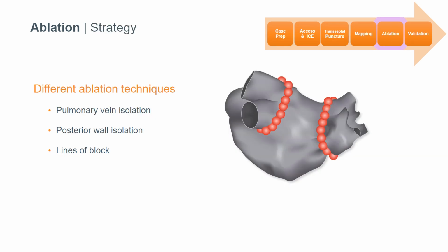The EP physician may use several different ablation strategies during an atrial fibrillation procedure. The most common, pulmonary vein isolation, involves ablation to electrically isolate the pulmonary veins. Linear ablation on the posterior or anterior wall of the left atrium may also occur in order to isolate additional areas of irregular conduction related to atrial fibrillation. Learning each physician's strategy can help you estimate how long this phase may take and anticipate when to alter your anesthesia care and the end of the procedure.